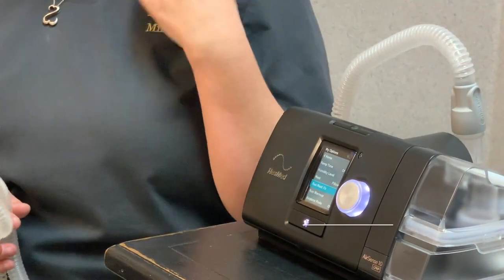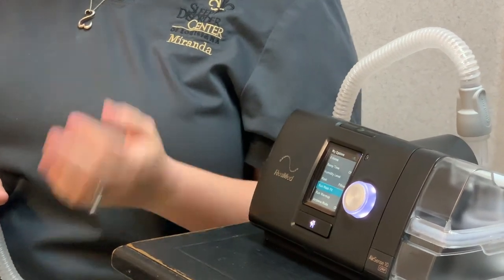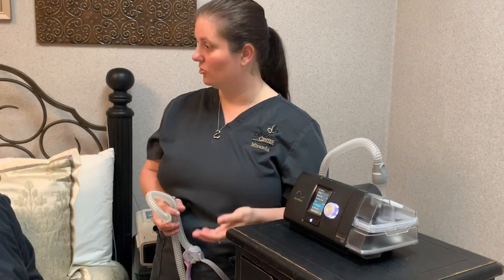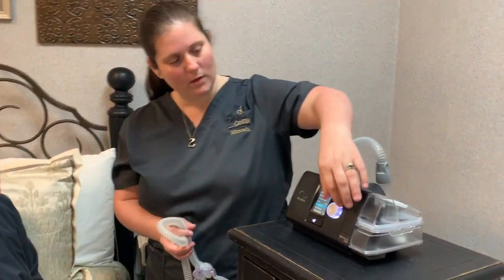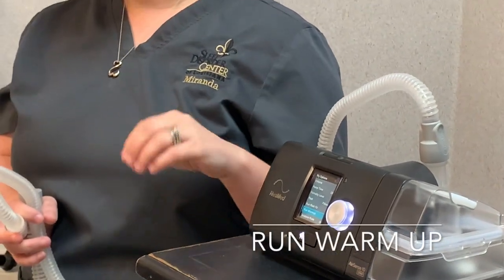You can also run a mask fit. You would put your mask on and just hit the button — it's going to give you a green face or a red face. If it gives you a red face, it's going to prompt you to do some adjusting until you get the green face, which means you have a nice good seal.